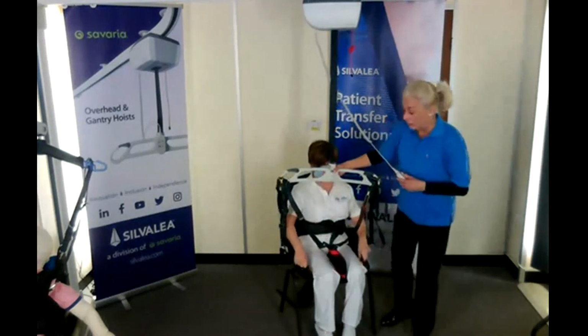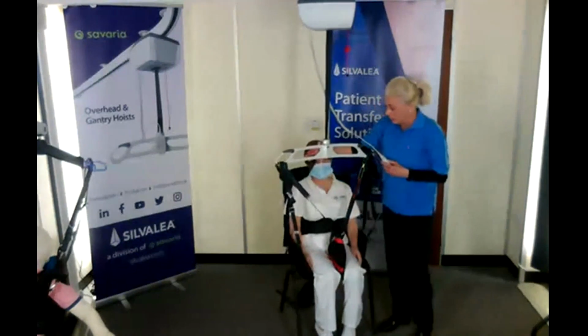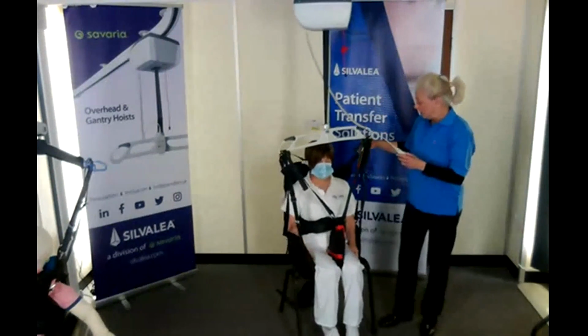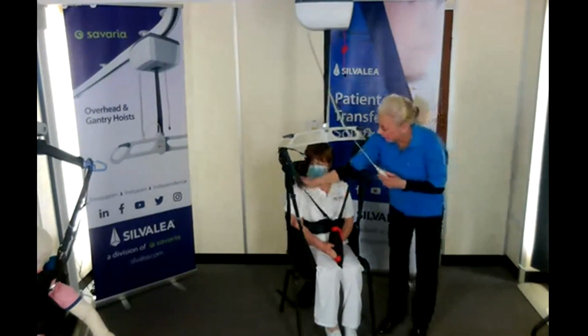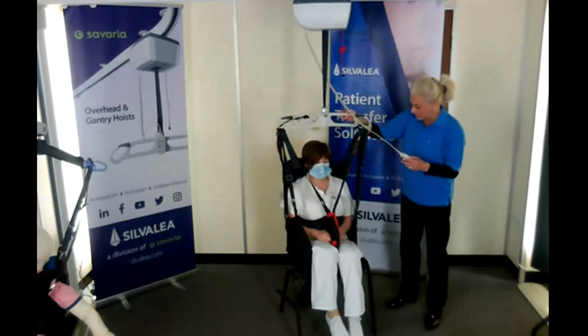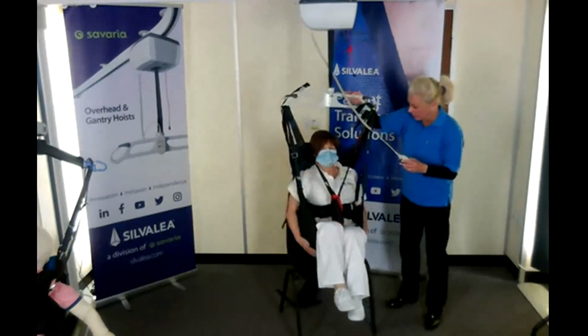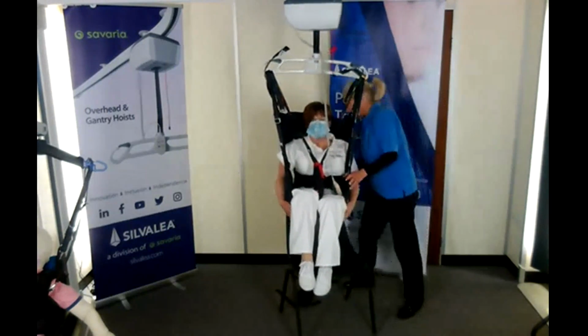Just going to take it up so slowly. And we know it's tricky. You know, you've got a wriggler, someone active, you're probably going to have a couple of carers just to get used to this and to fit it. But checking, we've got the legs, two hips and the shoulder at the moment. I'm just going to take up the slack. I haven't got your head support on yet, Jude. So we've bucketed it slightly.